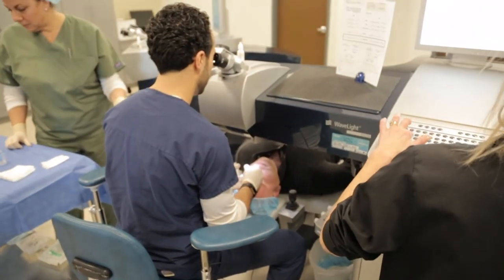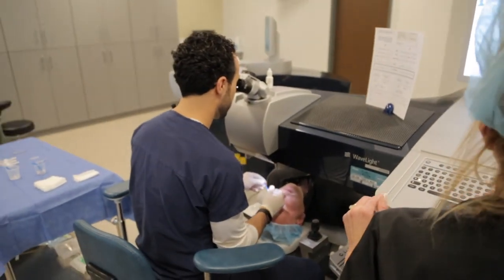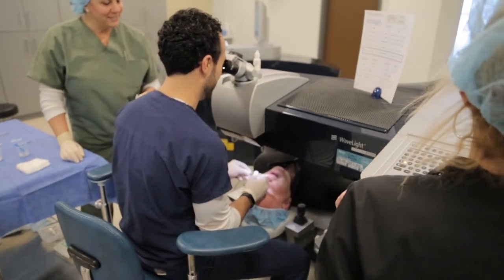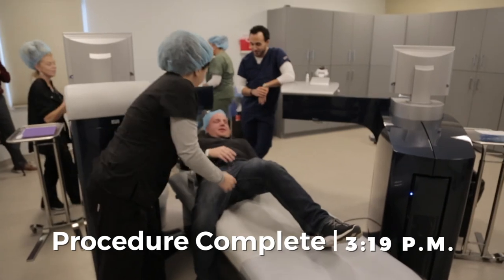Daniel, good job, buddy. Putting the final touches on here. Super glue? Well, I'm a perfectionist — but that's okay. You want your surgeon to be a perfectionist, right? Daniel, congratulations — the world of glasses is over for you.